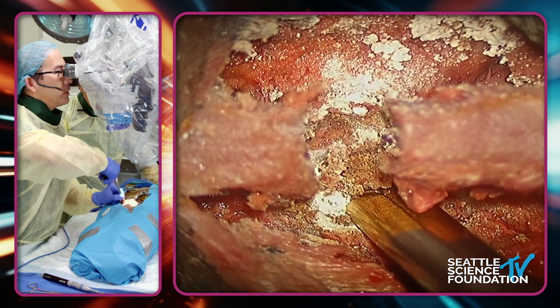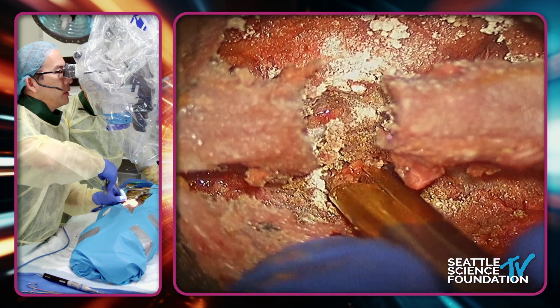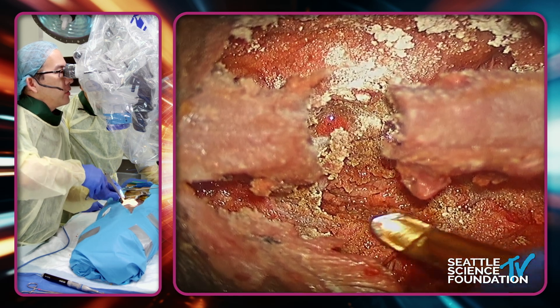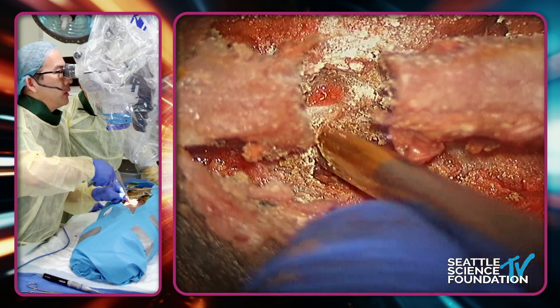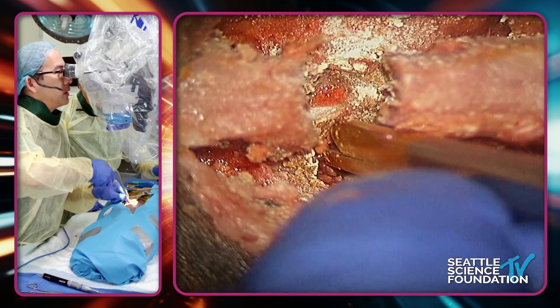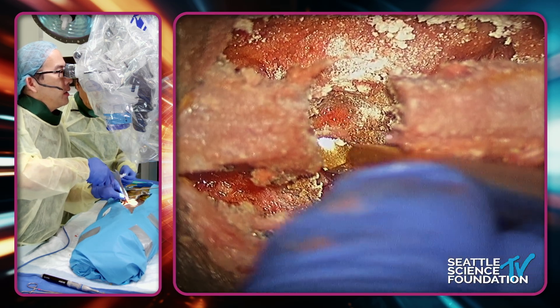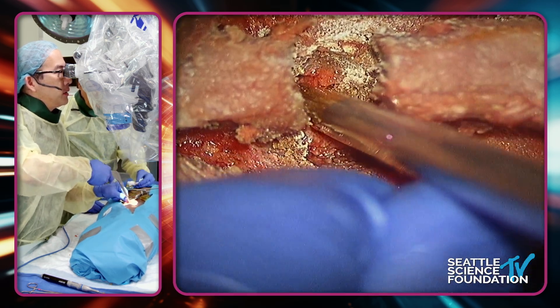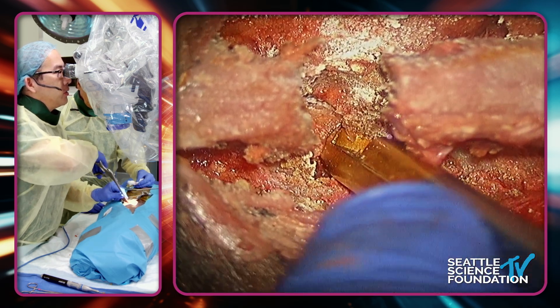With your Kerrison, you can start to finish the laminotomy. At this point you're still pretty safe from the thecal sac because typically there's a lot of ligamentum hypertrophy. I'm taking these nice bites, I'm undermining. So this is what we would call the landing zone up top, and then I'm going to find the landing zone down below.